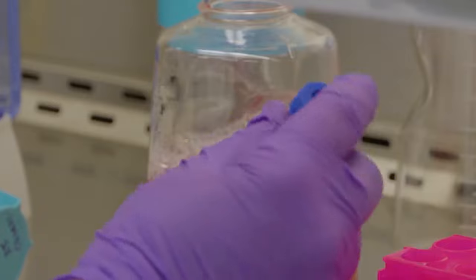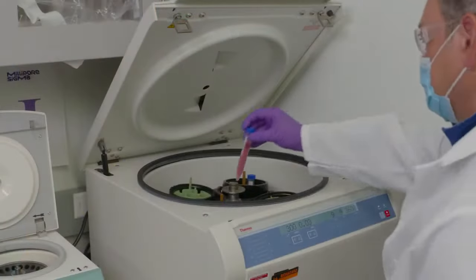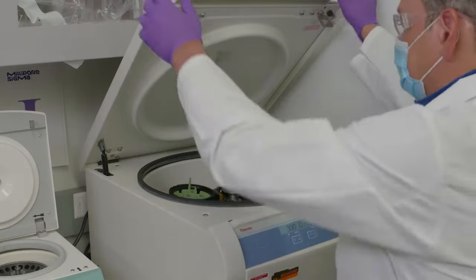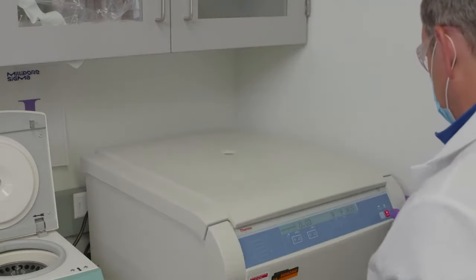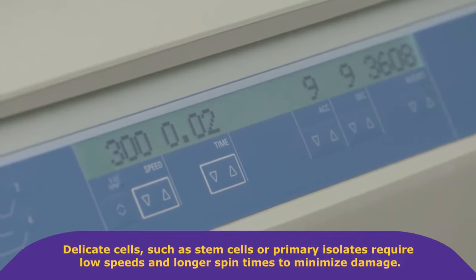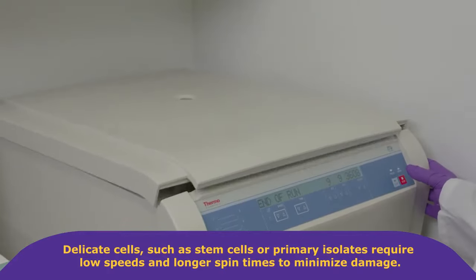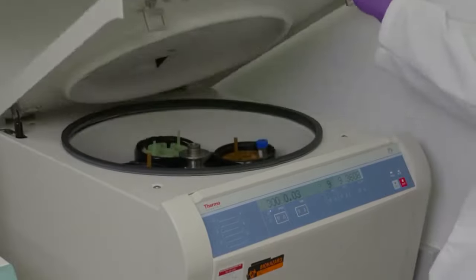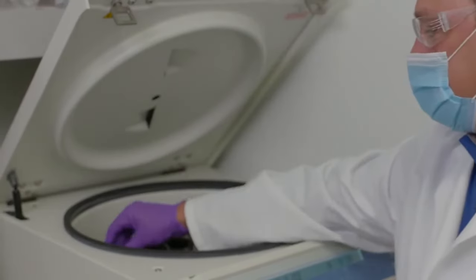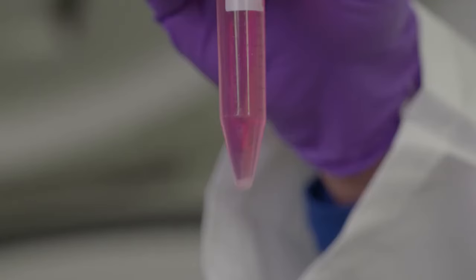The DMSO needs to slowly diffuse out of the cells to prevent bursting. This is accomplished through gradual equilibration. Mix cells by inversion — do not vortex — and pellet by centrifugation. The speed and time required to pellet will vary depending on cell type. Delicate cells such as stem cells or primary isolates require low speed and longer spin time to minimize damage. This wash step is performed to remove DMSO, which under standard culture conditions will interact with the plasma membrane causing loss of cell integrity.